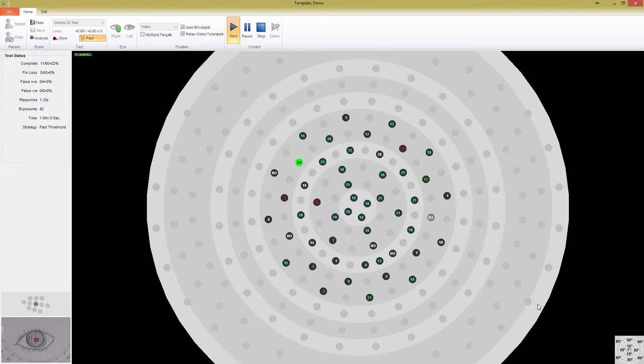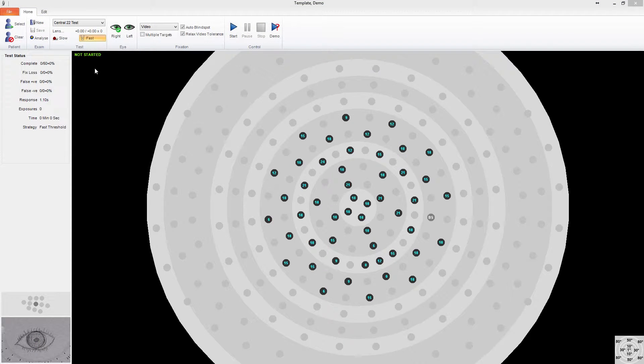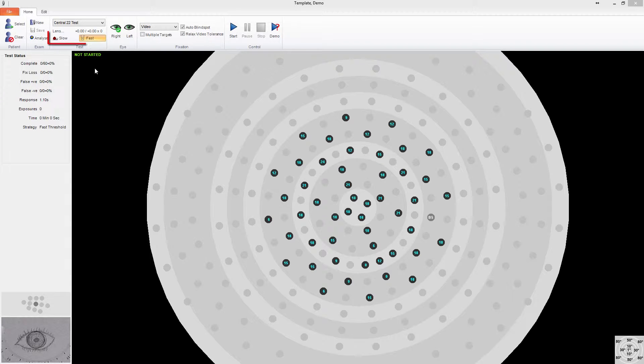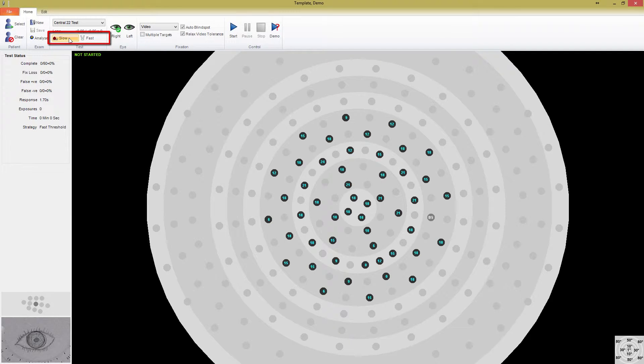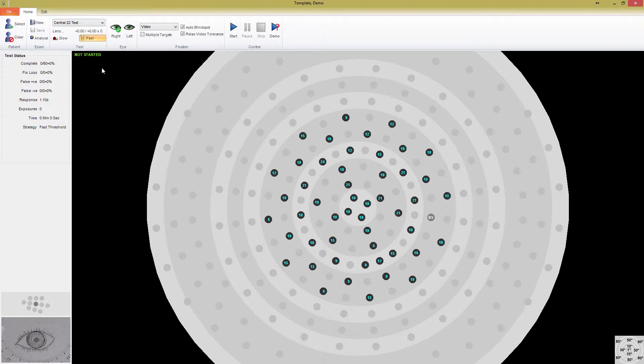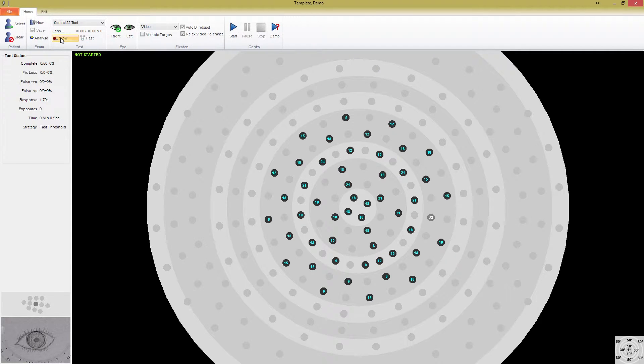I'm going to stop this test and start a new exam now. We've already looked at the patient and exam panels in previous videos, so let's get started with the test panel. The test panel gives you the option of a slow and a fast button. The test will start with the fast option selected, but if you notice that your patient is having a hard time responding to stimuli in time, you can press the slow button to give them additional time to respond. Of course, tests will complete quicker if you're using the fast button.